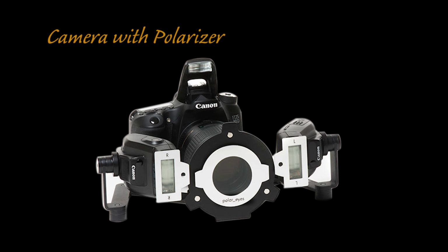But more importantly, what I'm trying to show here is the polarizer. That polarizer is what I'm talking about, that little white piece that goes over top the lens and over top the flash. Those are literally held on by magnets onto the lens and onto the flash. And it's a couple $100 add-on that you literally just click on or click off to be able to create that polarization effect. So might be something that you want to check into from your provider. And again, if you have any questions, don't hesitate to call.